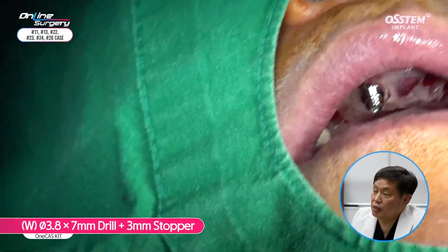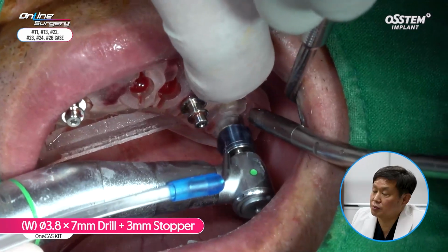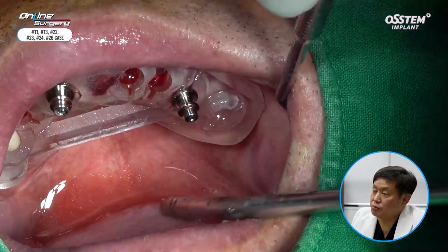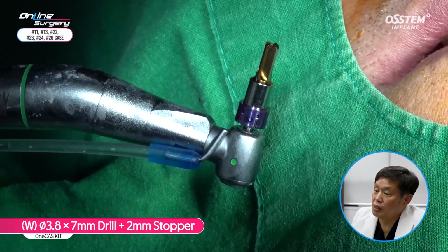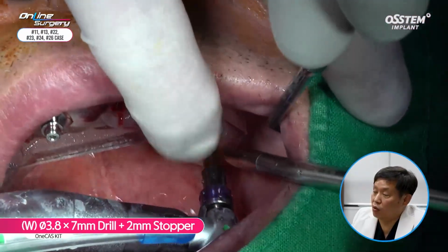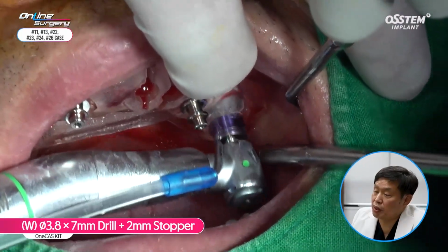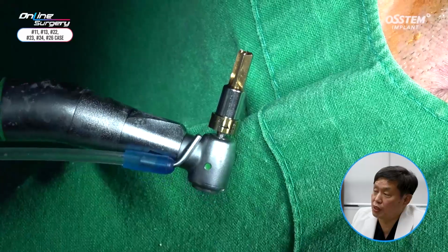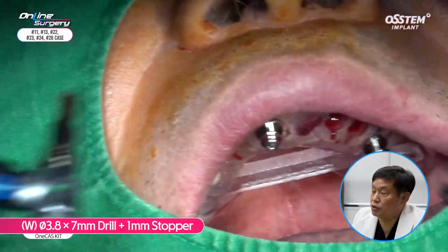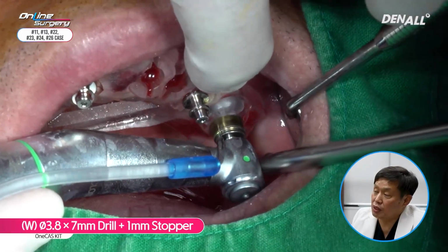For the final drill, a 3.8 by 7 millimeter drill with a 3 millimeter stopper. Drilling was done up to 4 millimeters. So we're going to move forward. 5 millimeter drilling was done using a 2 millimeter stopper, followed by a 3.8 by 7 millimeter drill with a 1 millimeter stopper. So drilling was done up to 6 millimeters.